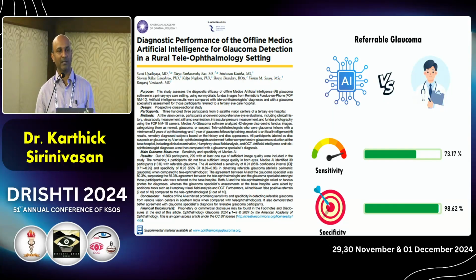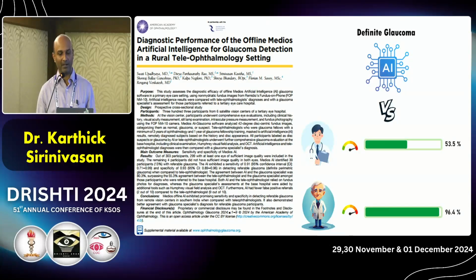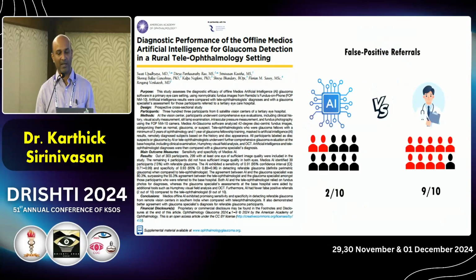So with this, did we prove that it is better than a doctor who is going to see it? Yes, we did prove that it has a specificity of 98%, and it gave a 96.4% definite glaucoma diagnosis when compared to 53.5% by a general ophthalmologist. And the false positive referrals in a camp: when you bring in 10 patients and say that 10 are glaucoma but they are not, you have to reevaluate, and it brings no value in bringing them to the base hospital and checking them up. But the AI algorithm gave a false positive referral of 2 of 10. So it is much better to have an AI tool to guide you in these things.